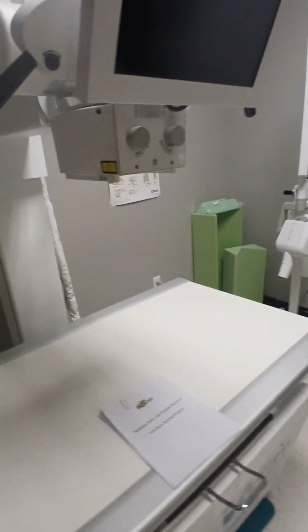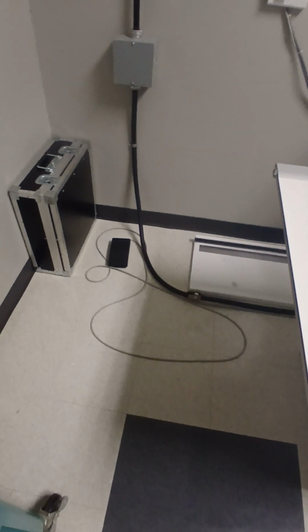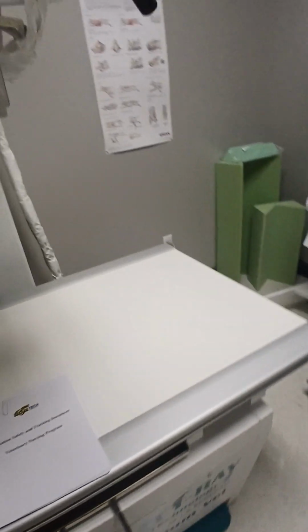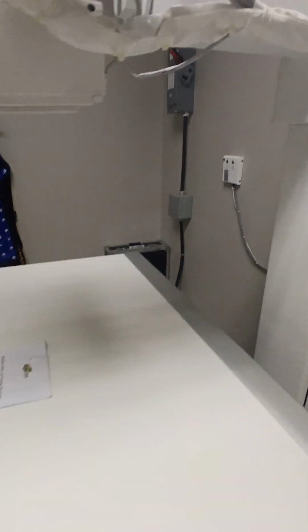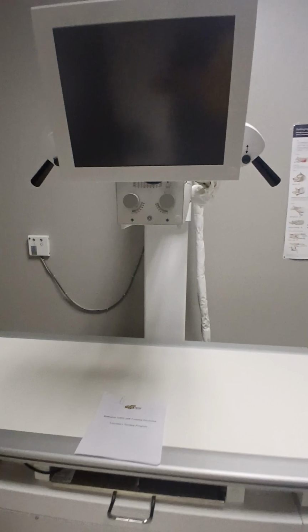So when we're talking about things like the x-ray tube, when we're talking about the dead man switch or two-stage switch, that's our foot pedal. When we talk about what, again, is happening on an electrical level, it's because all of this tubing, all of this wiring, all of these cords that lead back to our transformer is what's providing us with a massive amount of electricity to actually run the x-rays.